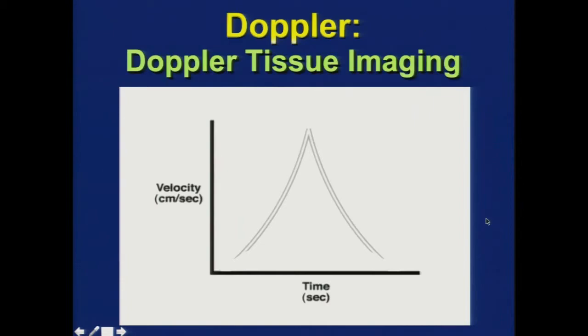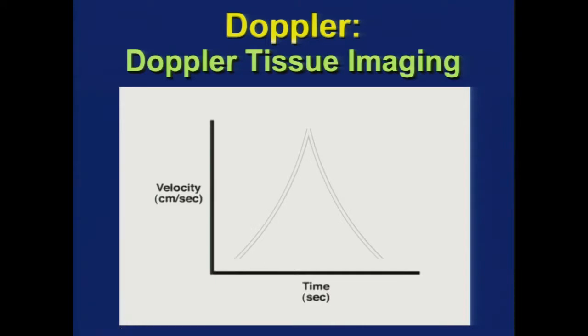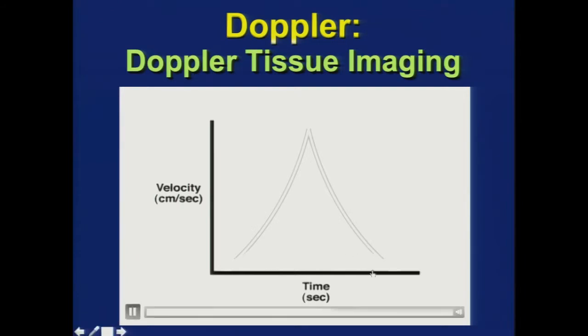This schematic illustrates the principles behind Doppler tissue imaging. Here in gray is the high velocity but low intensity signal that comes from the blood pool. This white bar represents the high intensity but low velocity signal that comes from the wall. Now, when we're looking at blood pool Doppler, the wall signal is really considered noise, so we need to turn the wall filters on. But in Doppler tissue imaging, that's the signal we're interested in, so we need to turn the wall filters off.